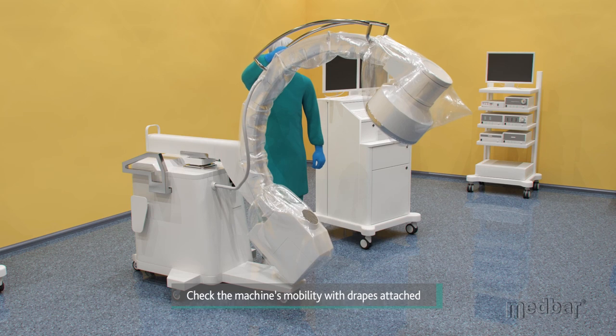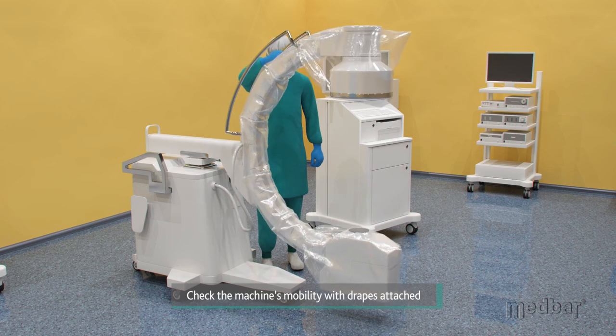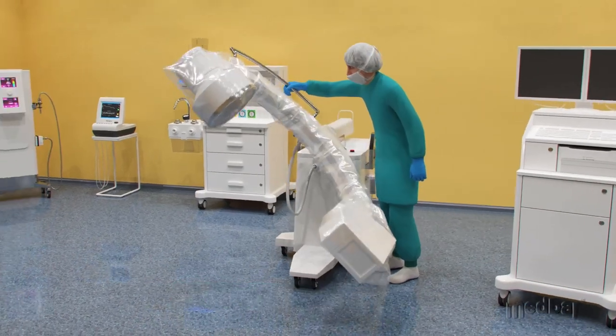With all three drapes applied, the C-Arm is allowed to rotate freely with zero chance of the drapes affecting the procedure by either coming in contact with the patient or by falling out of position.